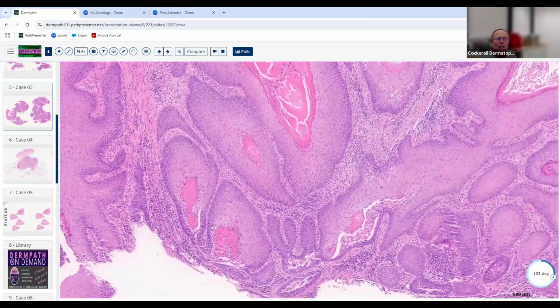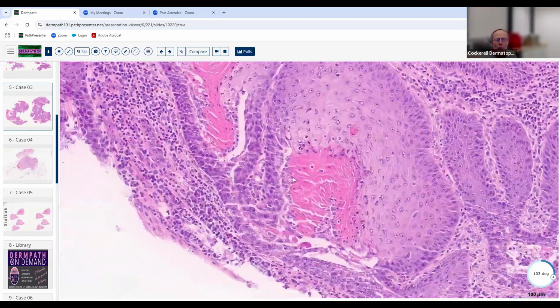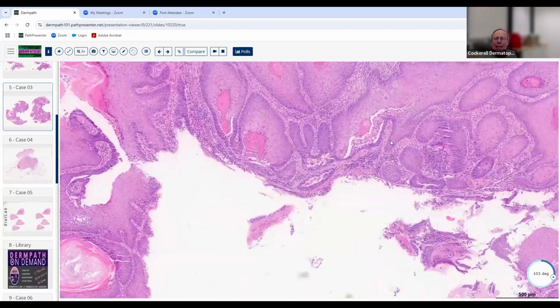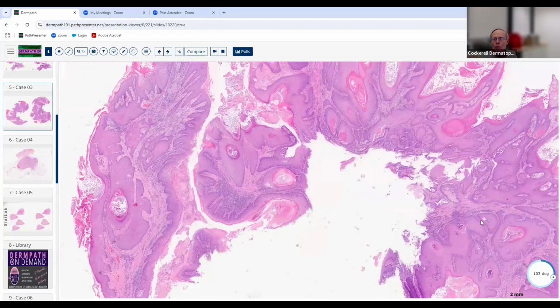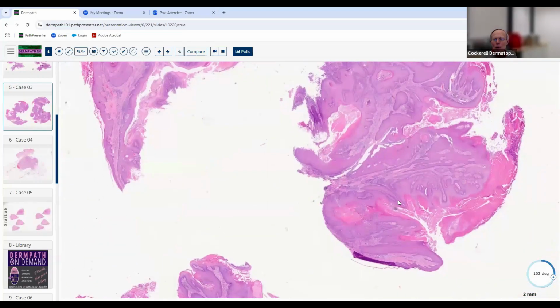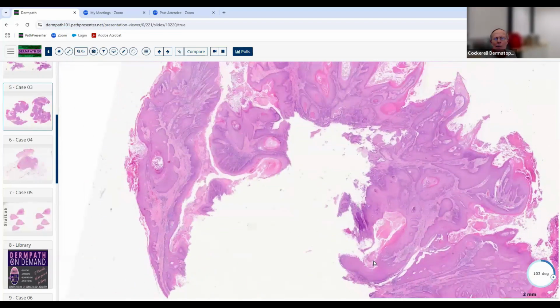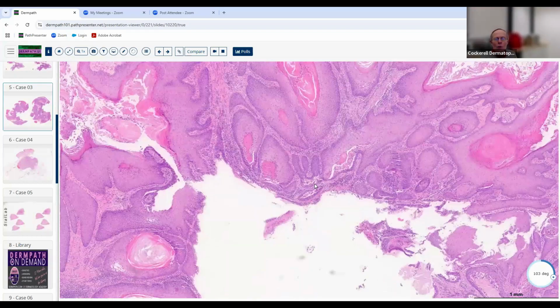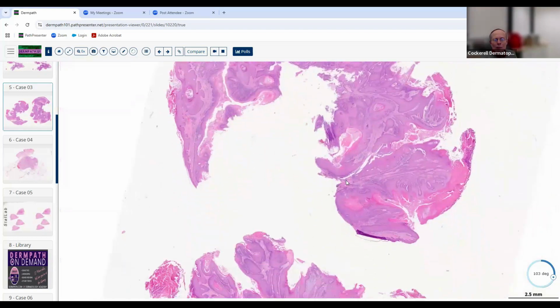So this is a similar kind of phenomenon that I just mentioned to you before. This is a nipple adenoma or erosive adenomatosis of the nipple. Same sort of idea. It's more endophytic here. This one's got a lot of warty pseudocarcinomatous hyperplasia, which you don't always see in nipple adenoma. A lot of times it's only this glandular epithelium here. So this is an example of a nipple adenoma.